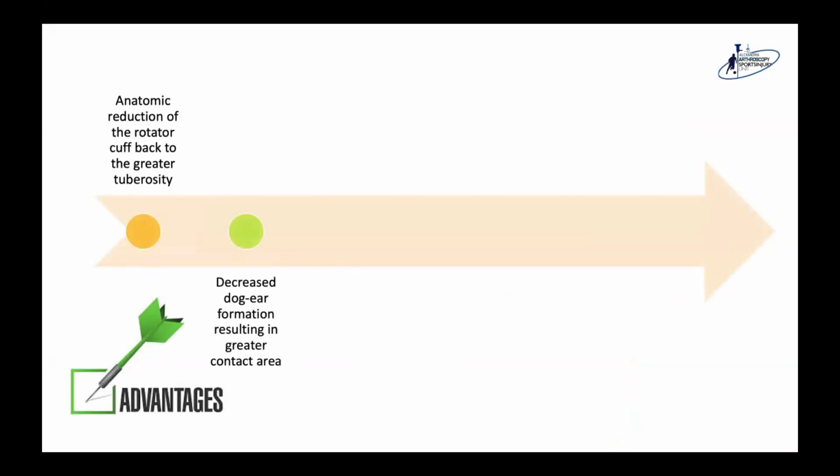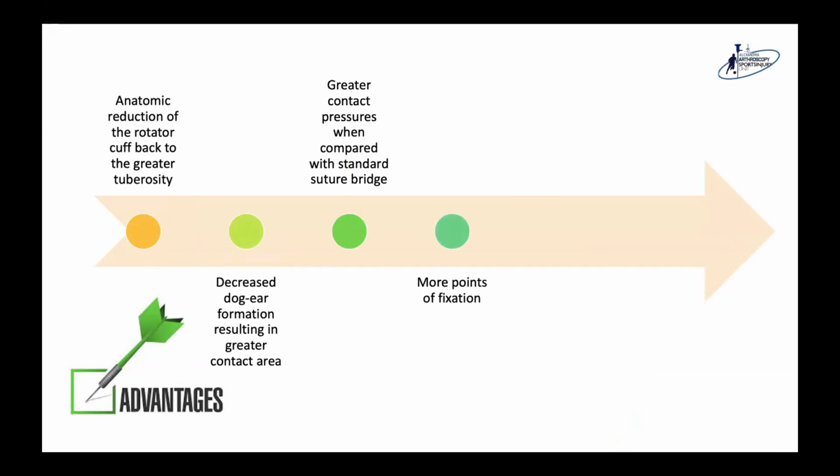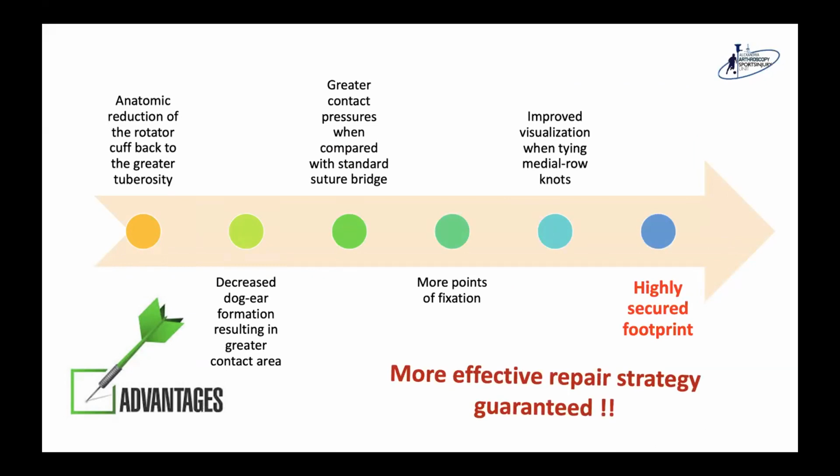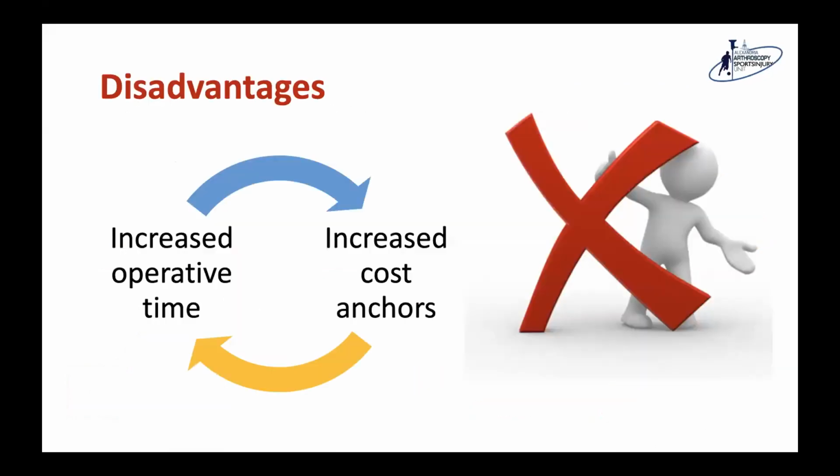So we have the advantages of anatomic reduction of the rotator cuff back to the greater tuberosity, decreased dog ear formation, greater contact pressures, more points of fixation, improved visualization when tying the medial row knots, and finally, highly secured footprint. So more effective repair strategy is guaranteed. The disadvantages are a little bit increased operative time and increased cost of the anchors.